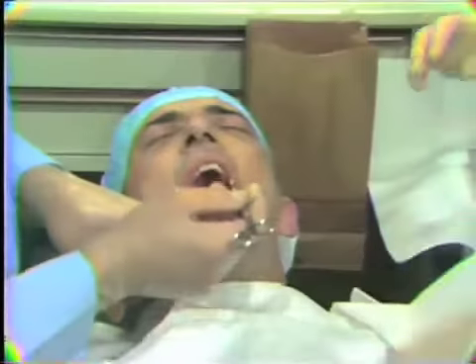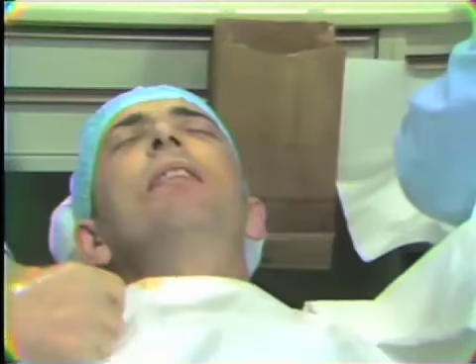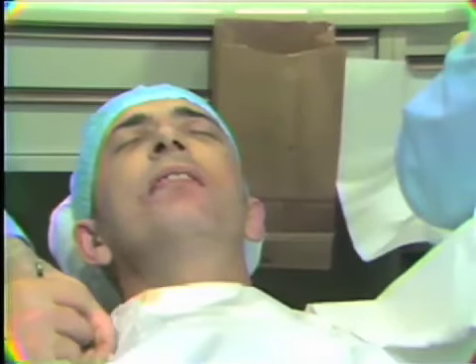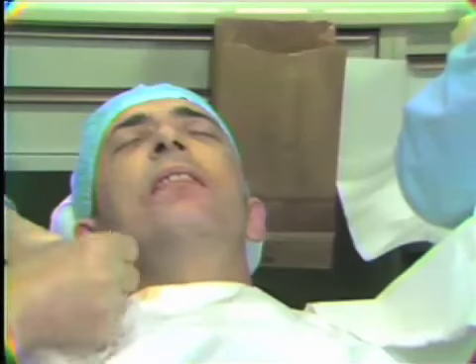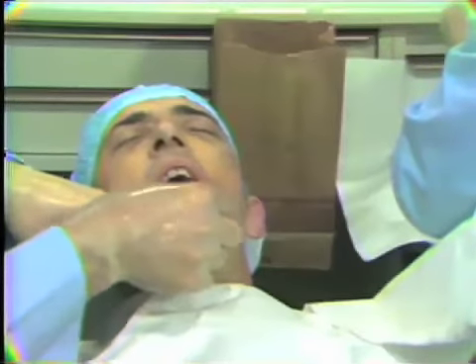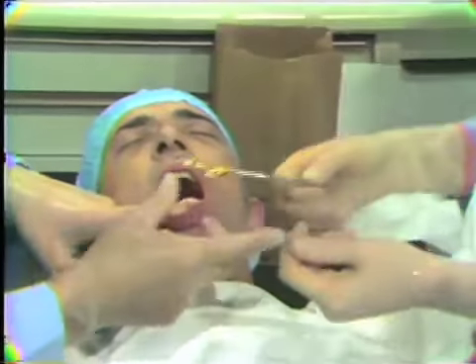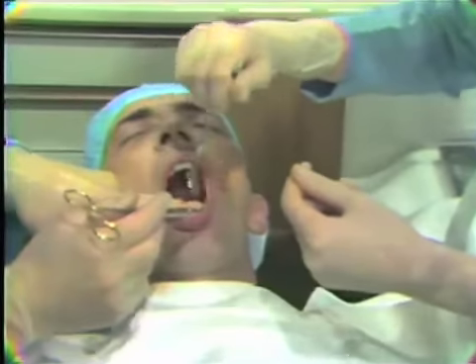Now, if I may have a suture. You may close and rest, Mr. A.G., a moment. As we are preparing the suture, the assistant has determined the access that we'll be making with the suture and is placing the suture in a manner in the hemostat so that we may go directly into suturing of the surgical flap. Will you retract the lip for me in that area?